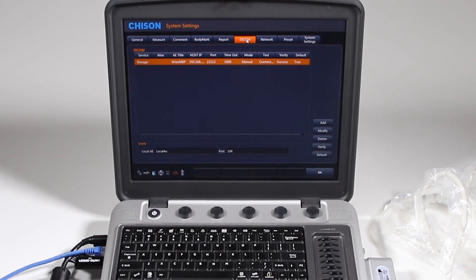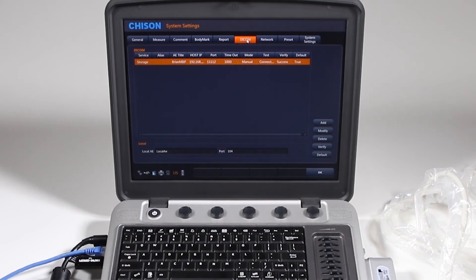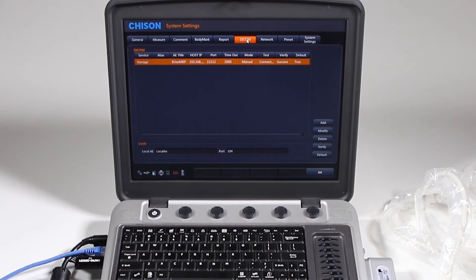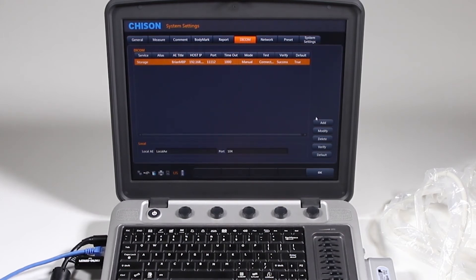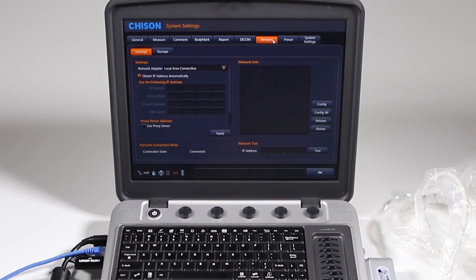DICOM setup, okay, this is a very complicated procedure, but on this machine it's not too bad. In general, before you do your DICOM, there's some things that you must have in order to complete it, and you have to talk to your IT person, first of all, to get your network set up, and we'll do that first.